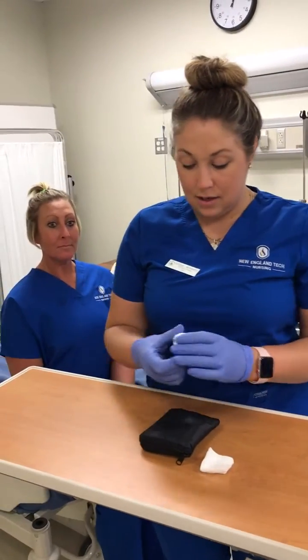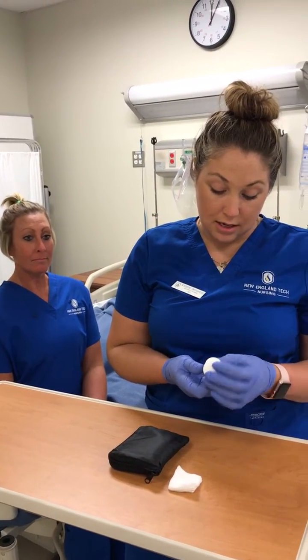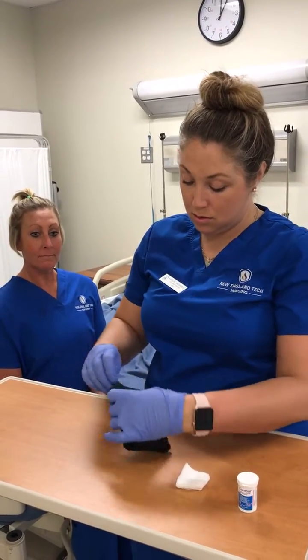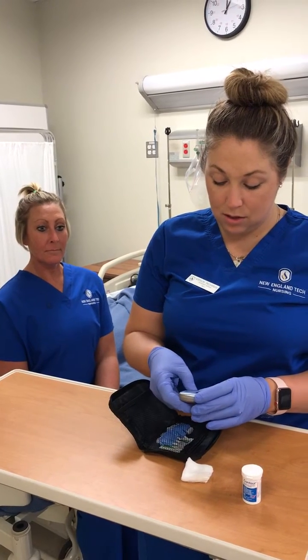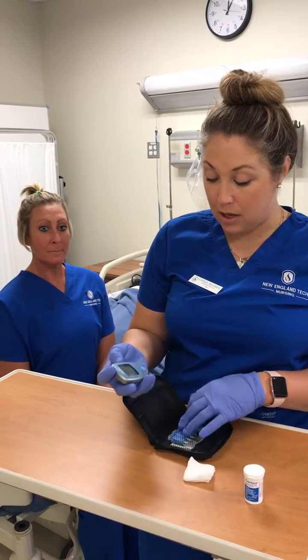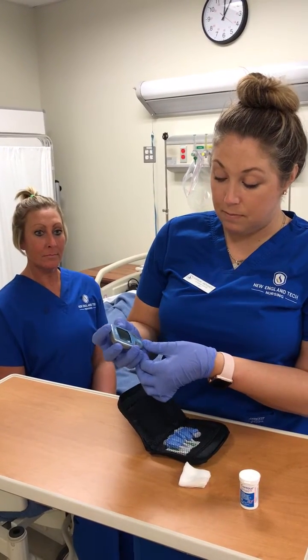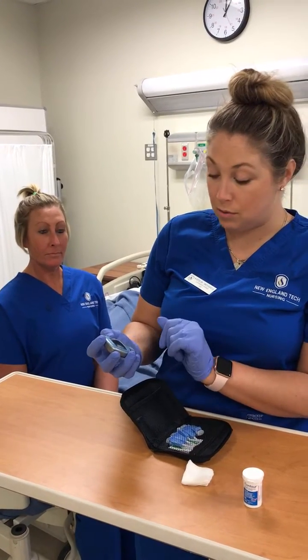First, I would take my test strips and make sure that they were not expired — and they're not. I would also take out my glucometer and test to make sure it's working properly. I would have a control strip, place it in, and it would show that it was reading properly.